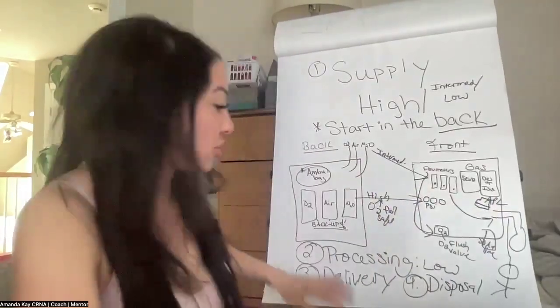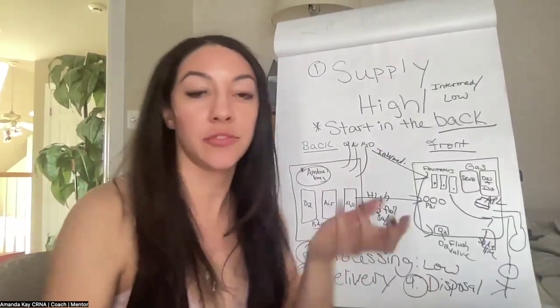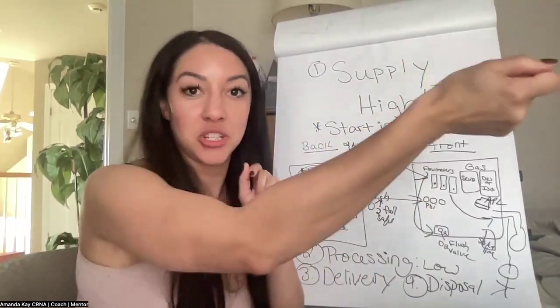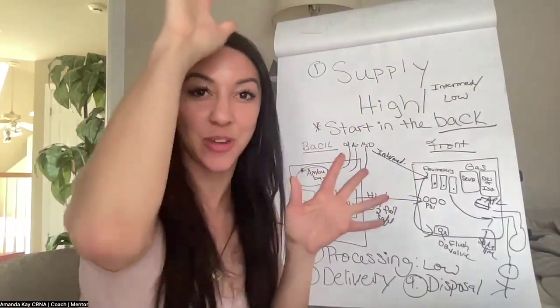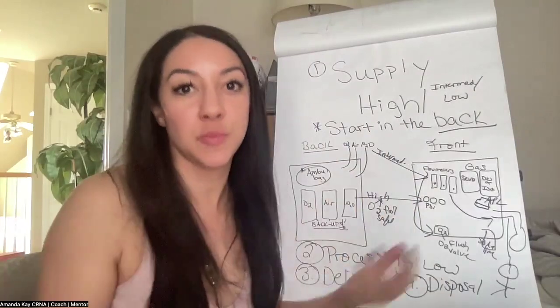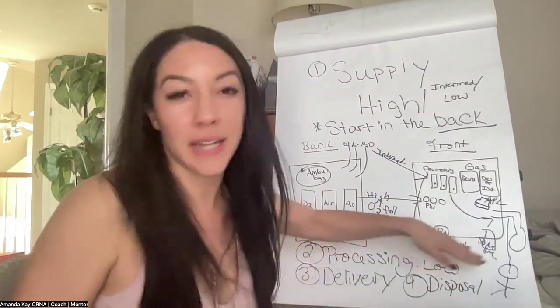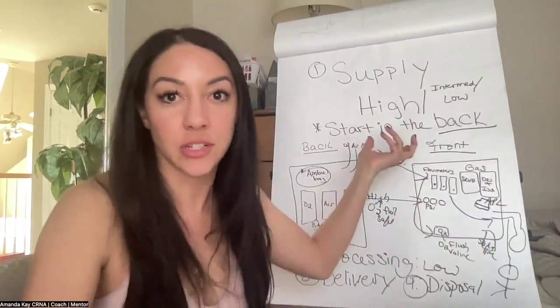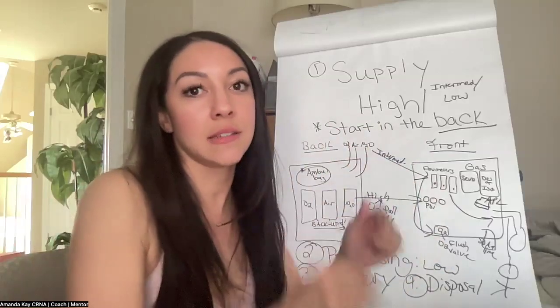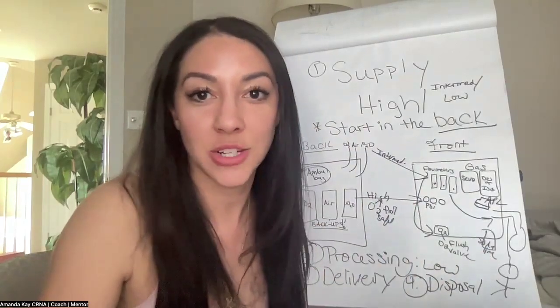Very quickly, last is just our disposal of gases. Not too much to say here. Every system will be a little bit different. When I was giving anesthesia on a mission trip in Africa, we had a hose and we just put the hose out the window. The gases went out the window. We do have scavenging systems, disposal systems here. Sometimes you have to turn a little knob to make sure it's okay, but it's usually underneath the machine. You'll see the scavenging system, because what goes in has to come out. So basically disposal of those gases is kind of like the last piece of that. Not really much for us to do with that.